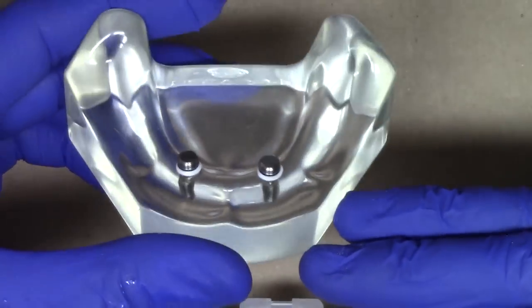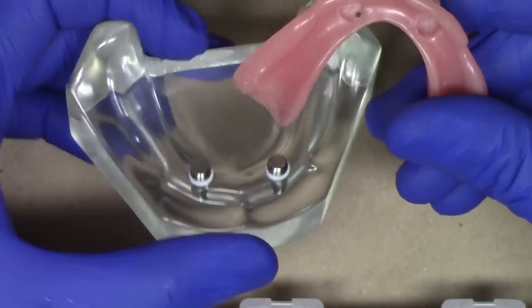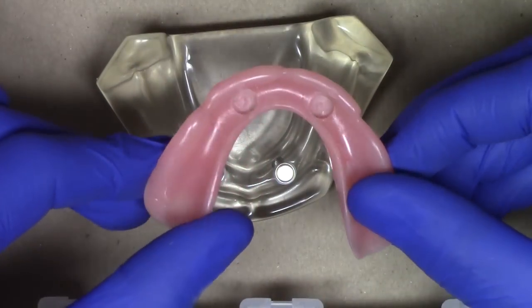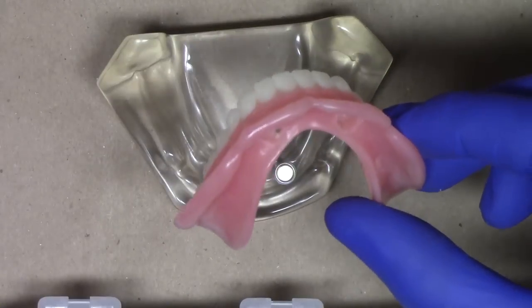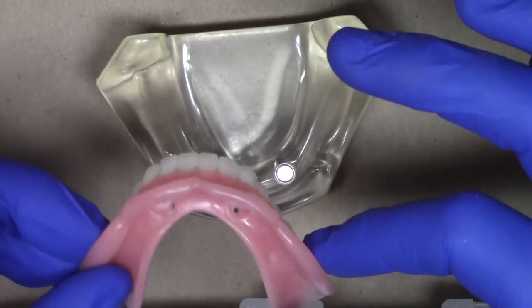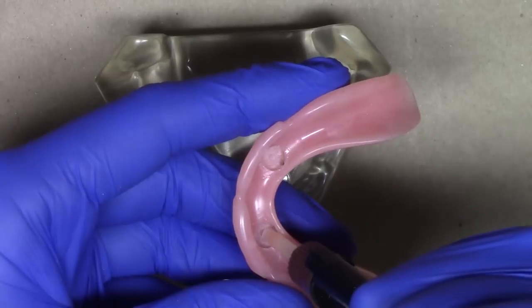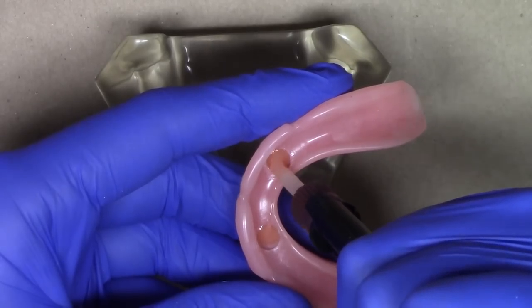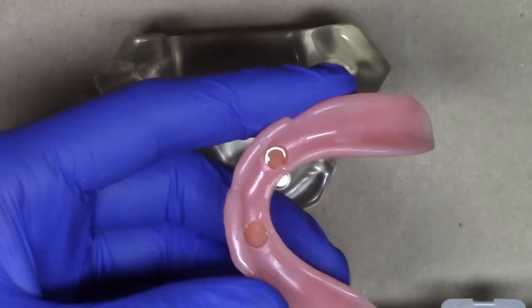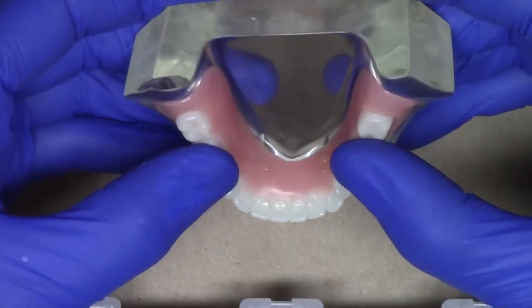Now at this point, we have our model and our patient all completely set, ready to go for processing these locator denture caps to the complete denture. As you've seen, I've already shown you using the undercut, recess, and vent hole burr. Since we're using the chairside attachment processing material, we don't need any sort of primers, bonding agents, or anything like that. I'm going to go ahead and utilize this material, filling my recess to about two-thirds of the way full, and then seating our complete denture onto our locator denture caps.